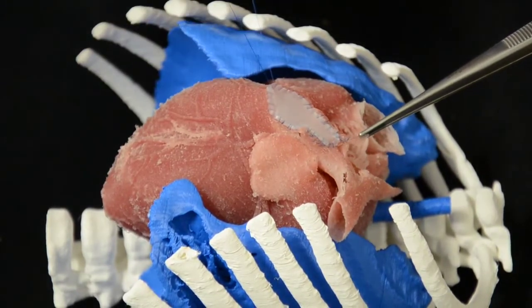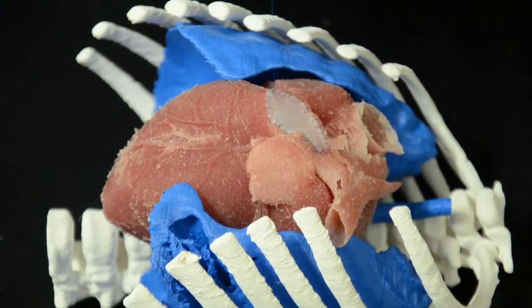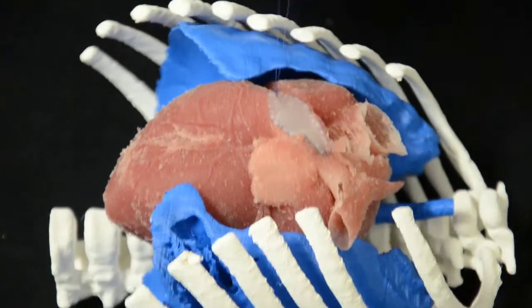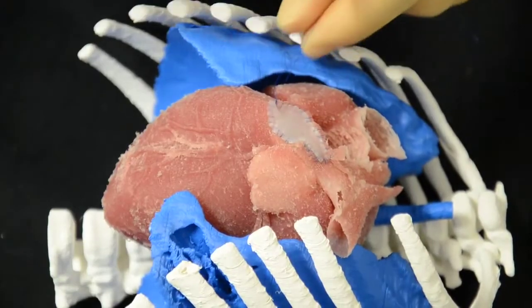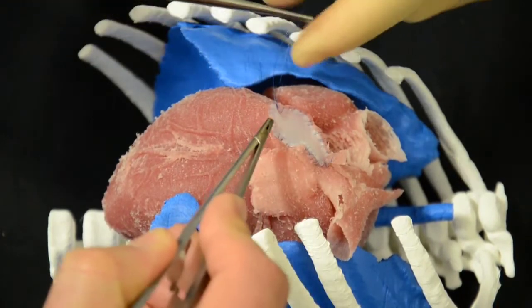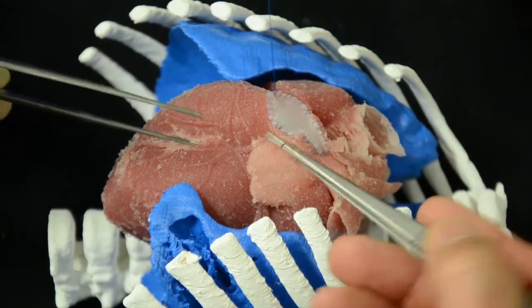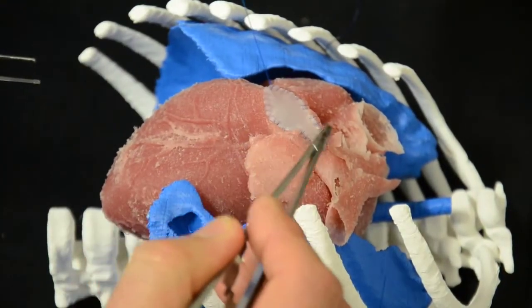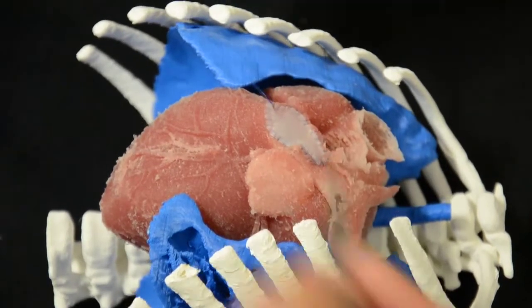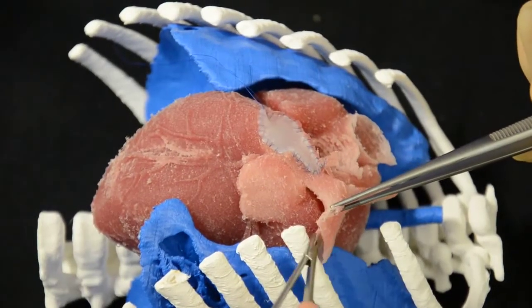That's a beautiful transannular patch of a pulmonary artery. Under normal circumstances the blood is circulating inside, so any blood would come out if you don't do it properly. Giuseppe has designed the patch in the perfect way, because if you do it too short or too wide, this will compromise all the surrounding structures. You need to trim and cut the patch in the perfect position for that patient. It's perfect to practice and train. It would be nice to stitch the pulmonary artery since the walls are very thin — here we can cause damage if the stitching technique is not perfect.